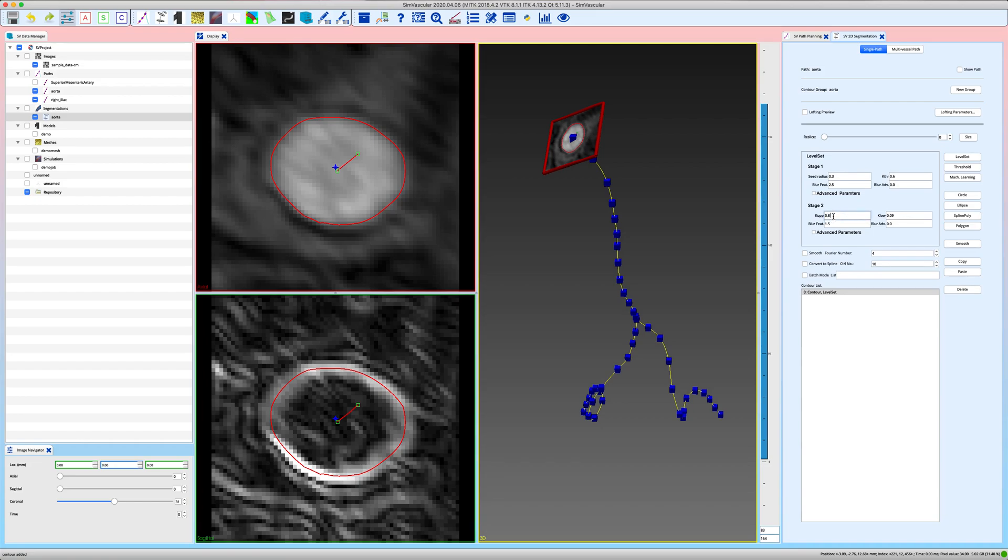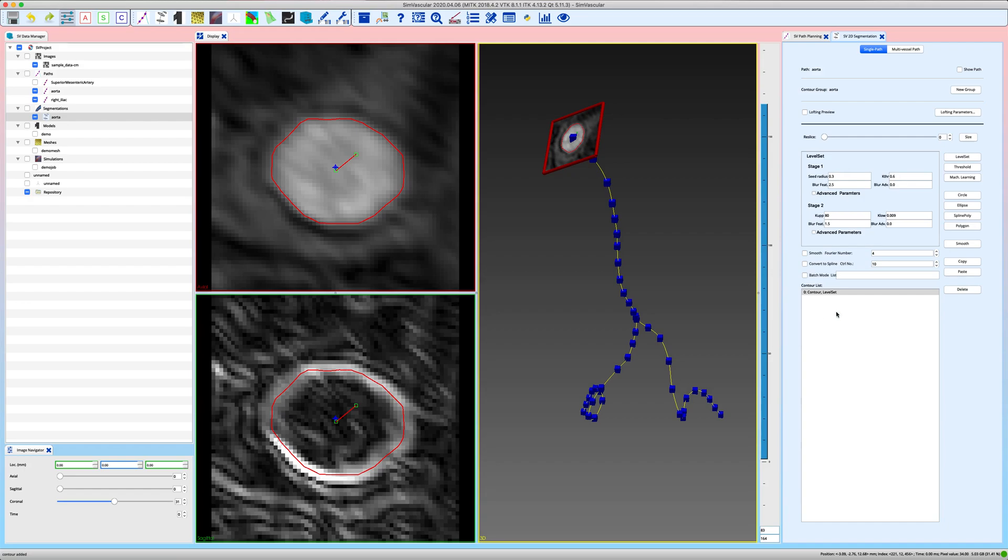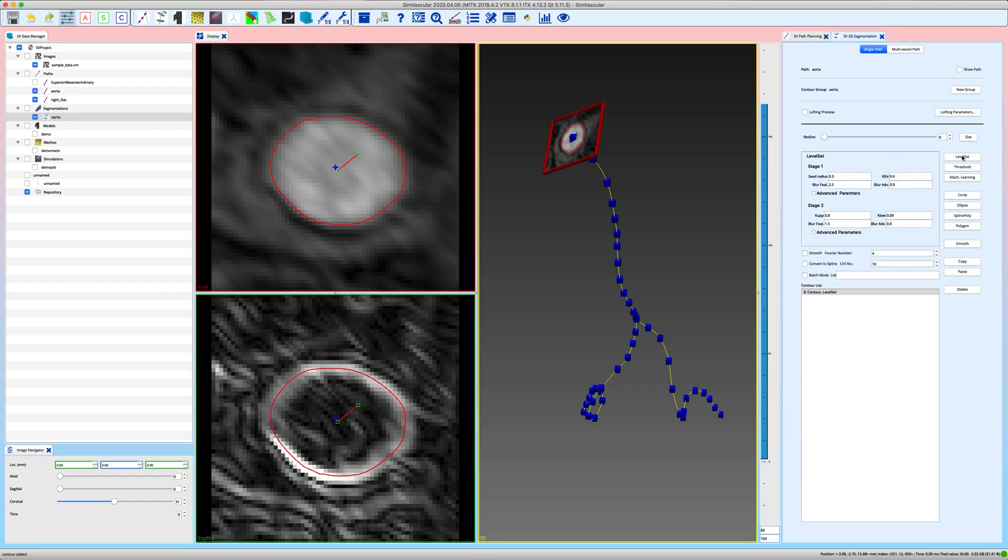And now just to give you an idea what happens if you really increase the curvature, like the upper bound of curvature to 80 and the lower bound of curvature make that one much smaller, and you create a level set just click on it again, you can see how the curvature of your final segmentation would increase too with all those sharper edges. Okay so let's go back to the previous set of values that we had, 0.8 for the upper bound and 0.09 for the lower bound. Click on it again. Okay that looks pretty good.